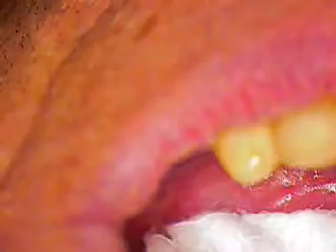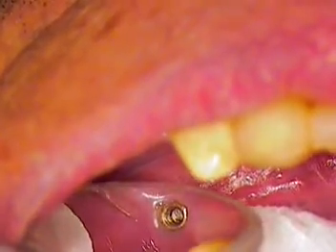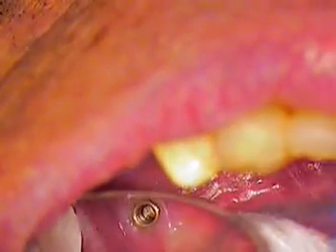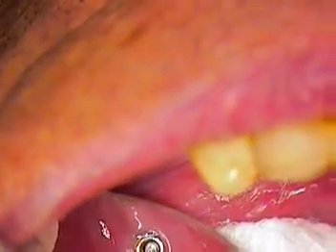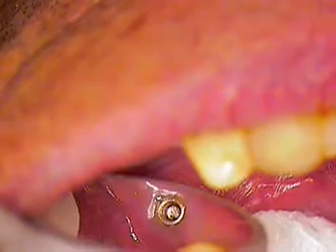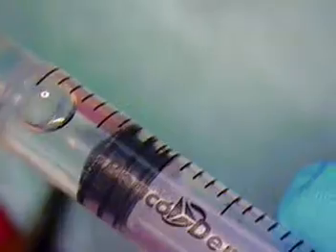Let's get right to it. What we've done is we took every precaution to not use the wrong instruments. You want to stay with blunt end instruments because you don't want to scratch any of the internal aspect of each one of these implants. We also want to use a solvent that can go in there and be very small, so we selected a very narrow lumen syringe. We took one of our acid etch syringe tips and jerry-rigged it to a 3 cc syringe and added a solvent material to that.